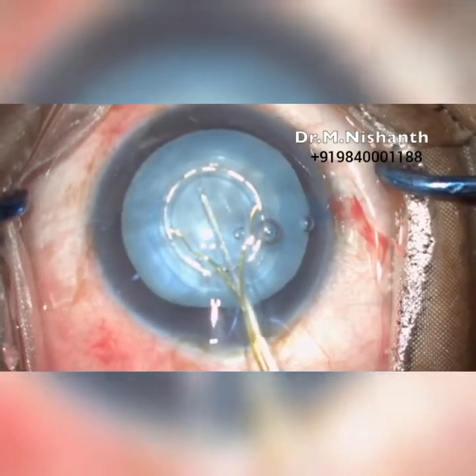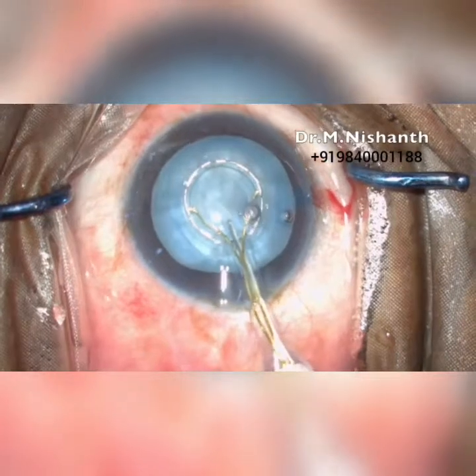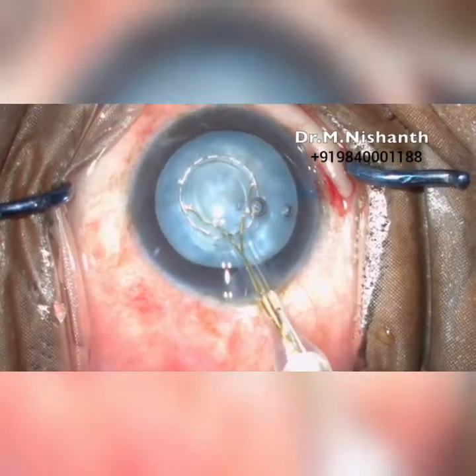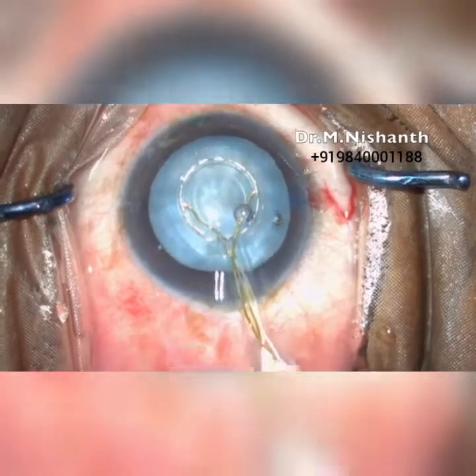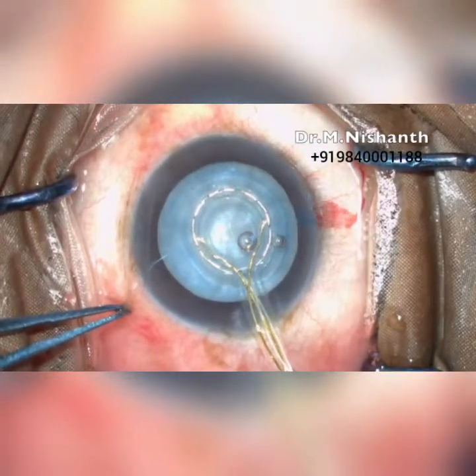Make sure you center the suction ring where you want the capsulorexis. Once aligned over the visual axis, suction is used to oppose the nitinol ring against the capsule. The air bubbles will stop moving towards the probe when the suction is adequate.